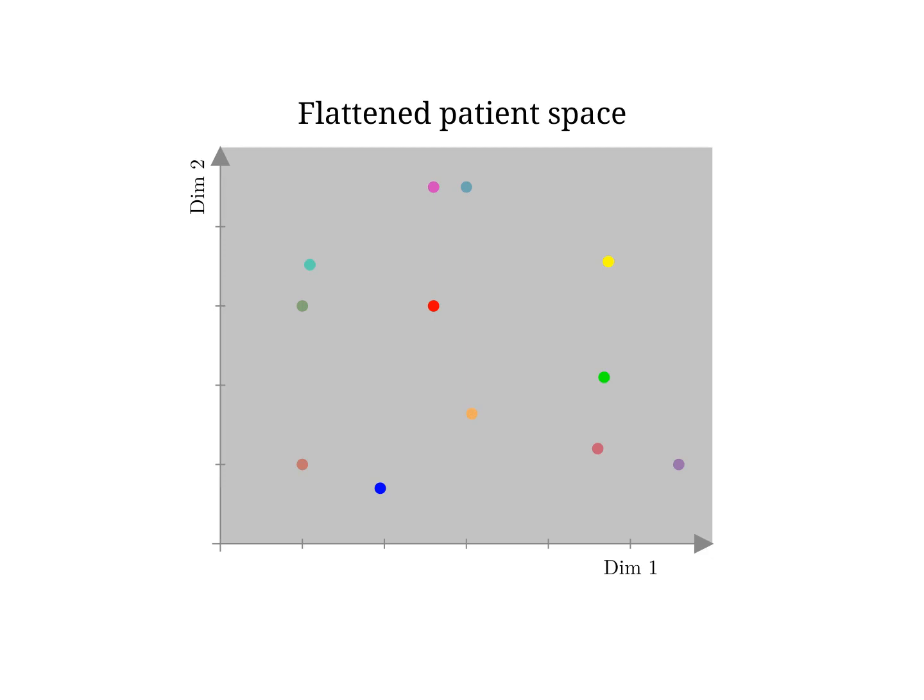Now what can we observe in this simple representation? Let us start by colorizing each patient point according to their status, with samples from the control group colored in blue and samples from the group with Alzheimer's disease in yellow. Do we see a separation between blue and yellow points? Can we identify a direction in simplified patient space that corresponds to moving from healthy to increasingly affected status? In this case, it turns out we can. One can now ask how the brain tissue changes when moving along this direction.